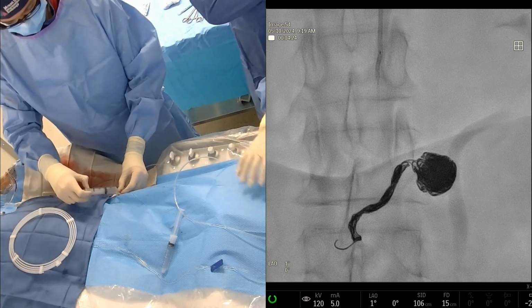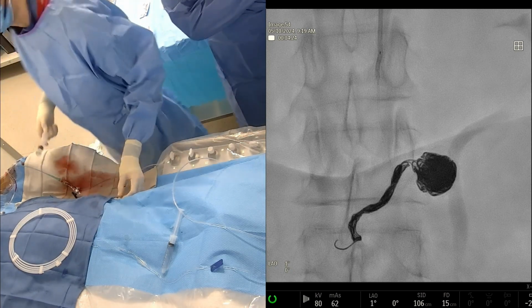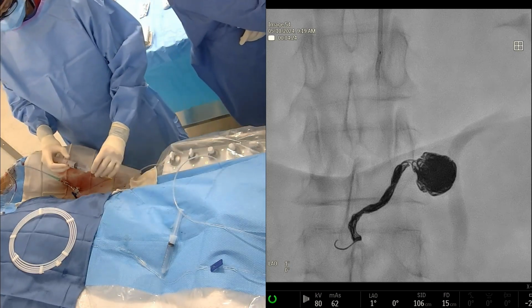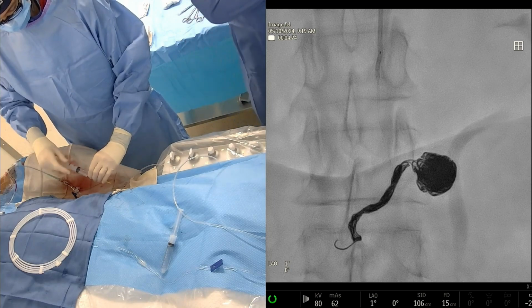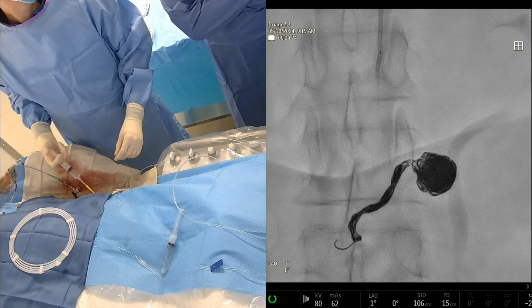So how many coils is this, Rahul? So that's three packings and then the 6 by 60. So we're at 240. So can we do another 60 packing? I think it's going to take it. Yeah. If not, do you think this Embold platform allows you to use fewer coils, Rahul?